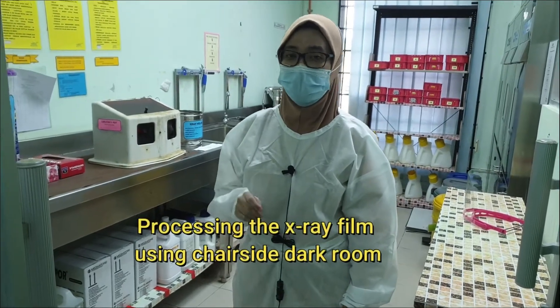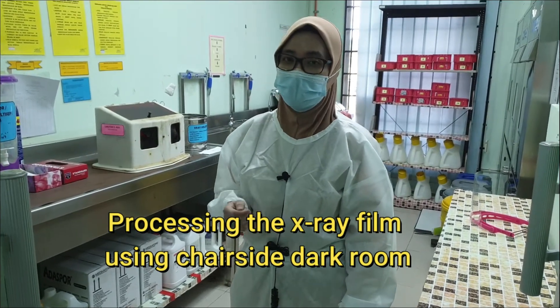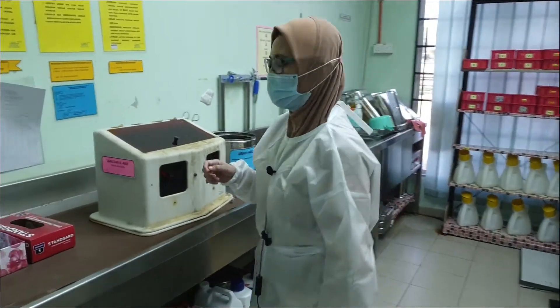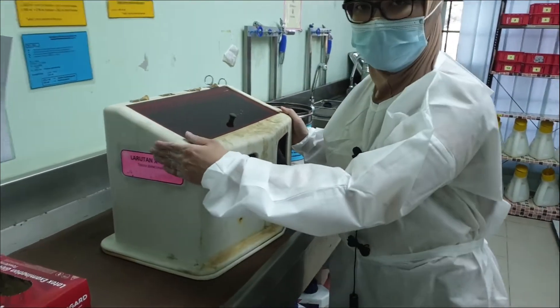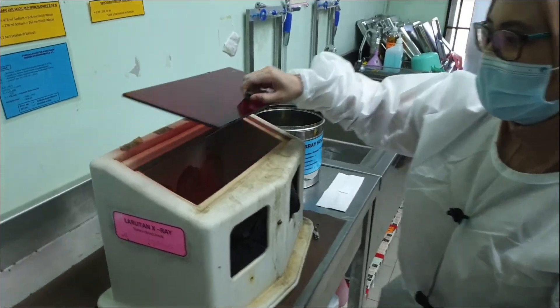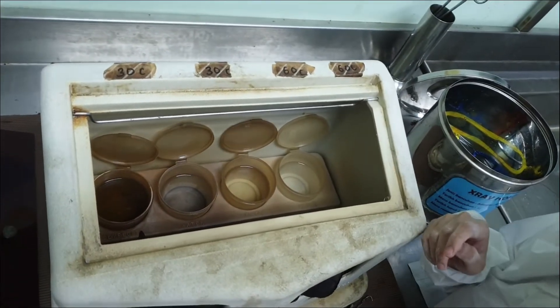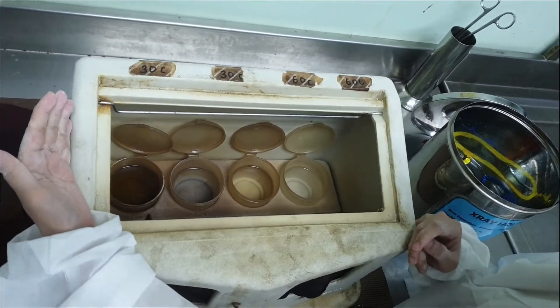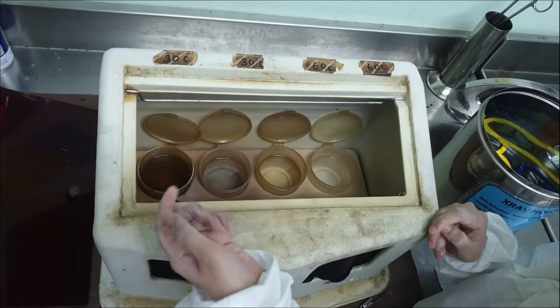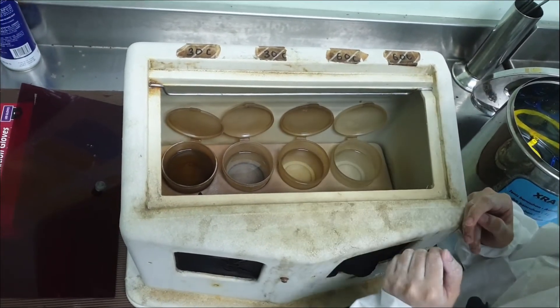After you have successfully taken the x-ray, you shall bring the x-ray film to the chair-side darkroom for processing. Let me show you what we have in the room. This is the box where the x-ray solutions are placed. Inside, there are four containers — the very left side contains the developer, next to it is water, then the fixer, and the rightmost container is again water.